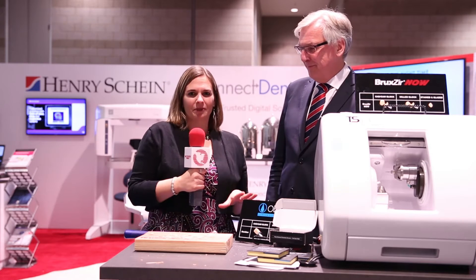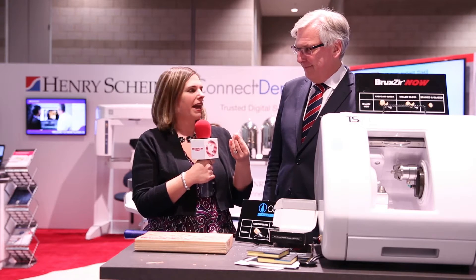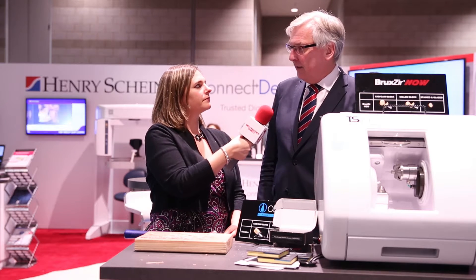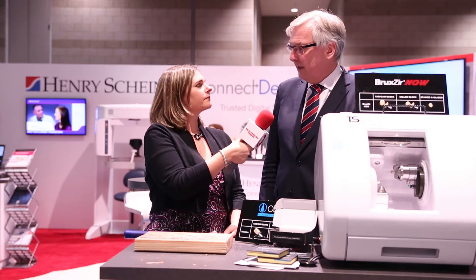Thank you so much, Ali. We always have so much fun talking to you — there's always something going on at Henry Schein. We're definitely going to have some fun today, but before we get to that, tell me about this new product. What we are very pleased to introduce at this meeting is the Zirconia crown that you can do chairside. BruxZir has been around for a long time — there are over 10 million restorations in patients' mouths with BruxZir — but this is the first time you can have a block, put it into a milling machine, and produce this chairside in about an hour and a half.